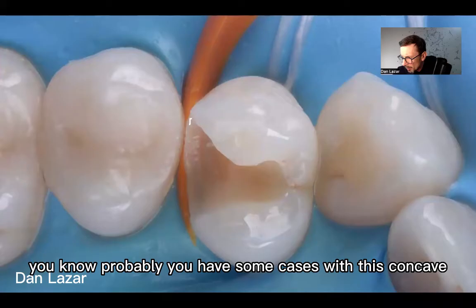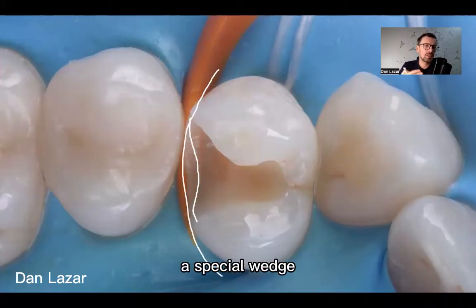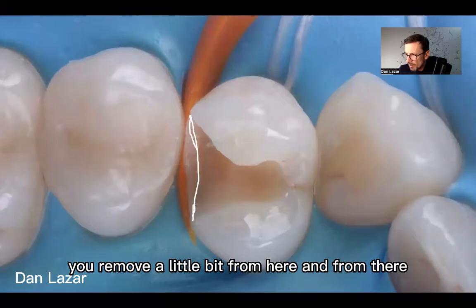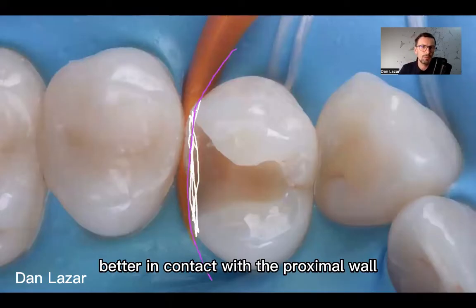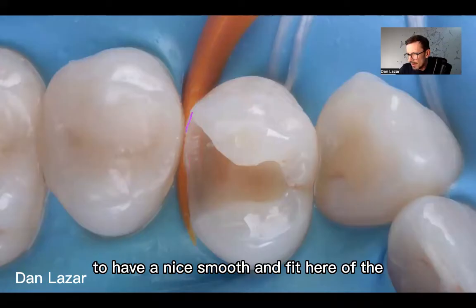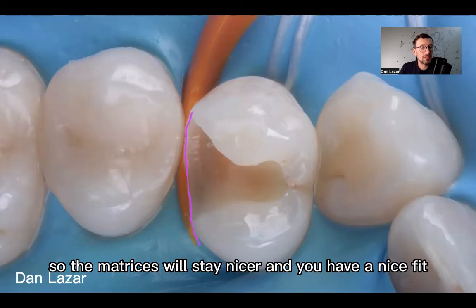This line has to be very nice and smooth in the cervical area. If it's concave — you may have some cases with this concave shape — the matrix will stay in that concave way. So how do you solve this? You can use a wedge, a special wedge that pushes the matrix toward this area, or another tip and trick that could be useful is to change this shape. You remove a little bit from here and from there, so you change the proximal area to be more straight. In this way the matrix will stay better in contact with the proximal wall and the proximal part of the cervical area. So: first trick — open the cavity. Second — have a nice smooth fit of the enamel or whatever is there, so the matrix will stay nicer and you have a nice fit.